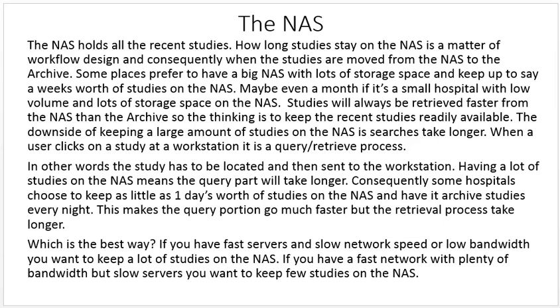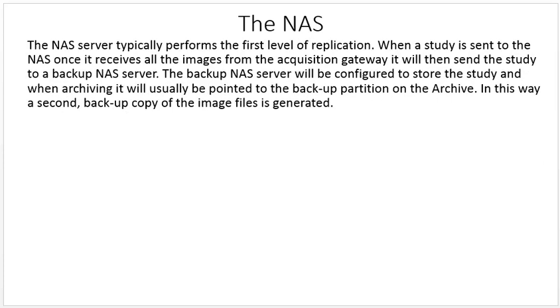Which is the best way? If you have fast servers and slow network speed or low bandwidth, you may want to keep a lot of studies on the NAS. If you have a fast network with plenty of bandwidth but slow servers, you may want to keep few studies on the NAS. It really just depends on your configuration.